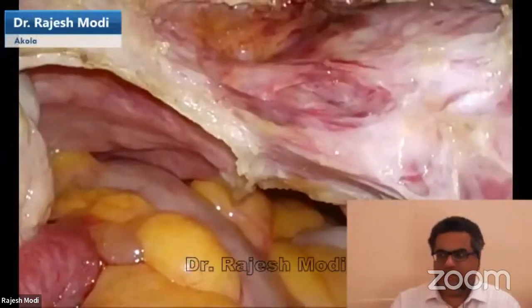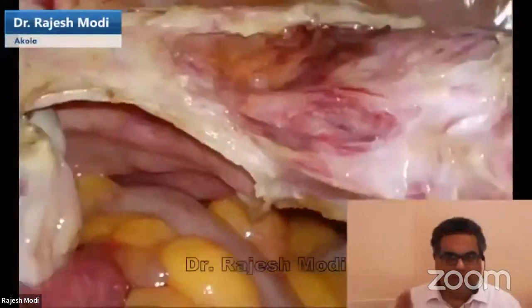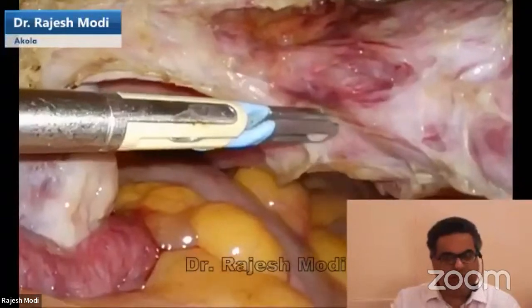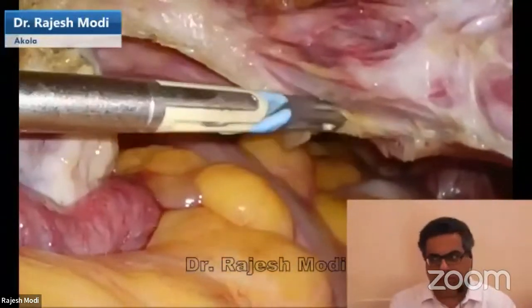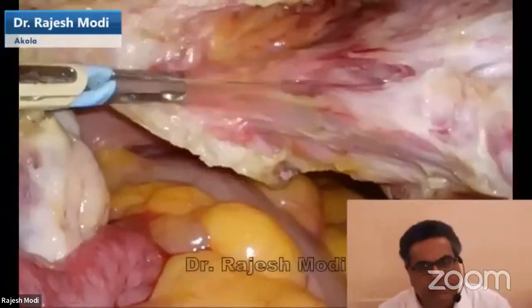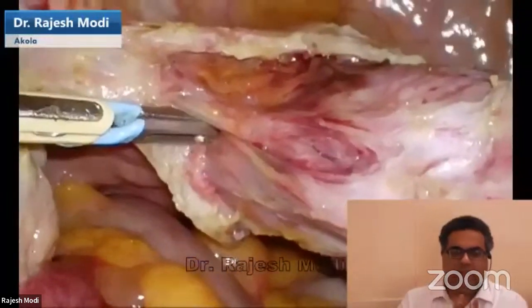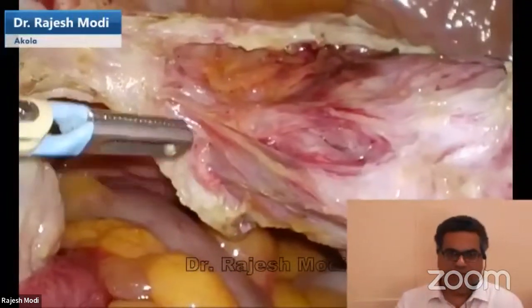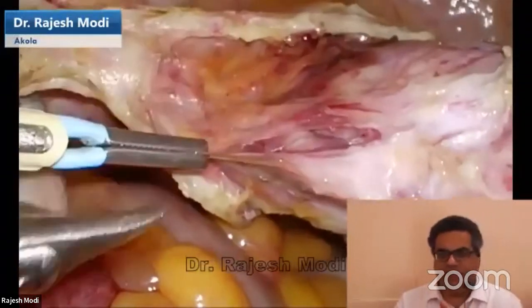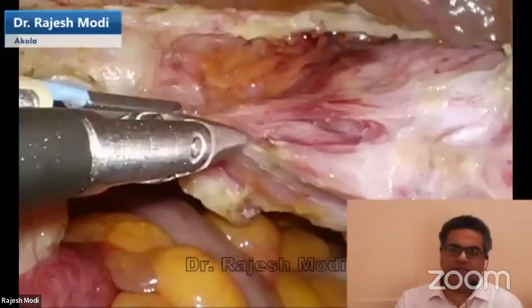One more surgery where I'm showing the dissection with a simple bipolar, the same concept. It is enough to have simply pushed the bladder down. It is enough to have simply let the posterior wall of the broad ligament go down, but go one step ahead. Whether you are using a simple bipolar or a thunderbeat or a harmonic, it really does not make a difference. The outcome of a hysterectomy depends more on your ability to do the surgical dissection in the correct plane. If you are in the correct plane, the chances of having any bleeding or oozing are minimal.